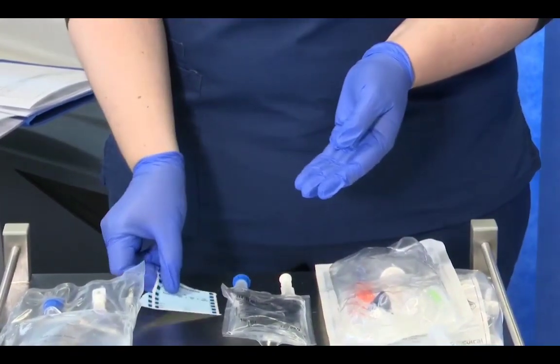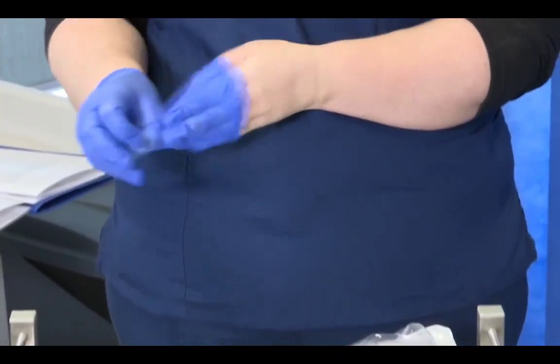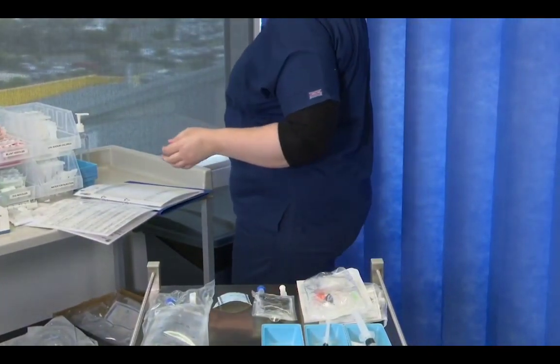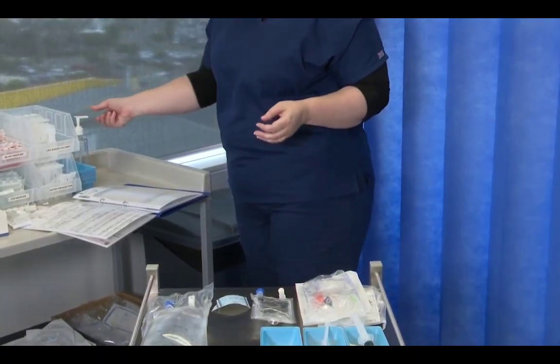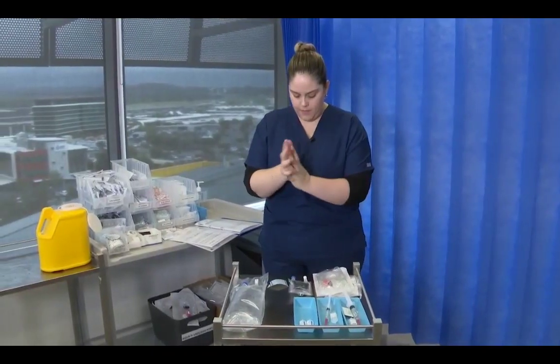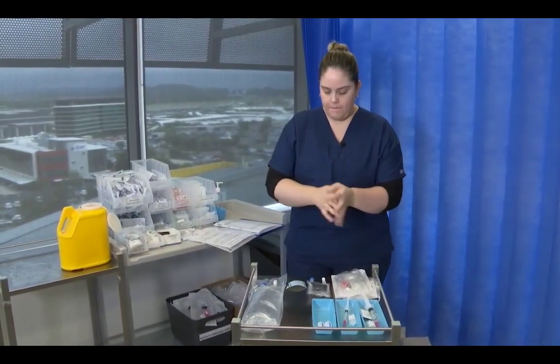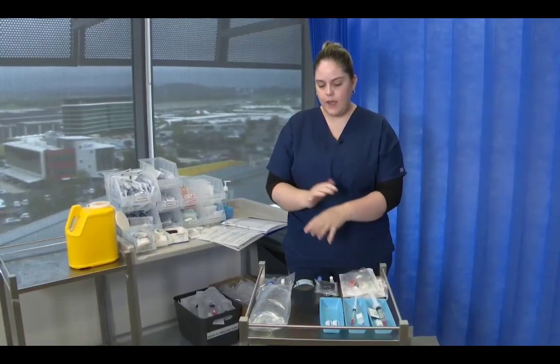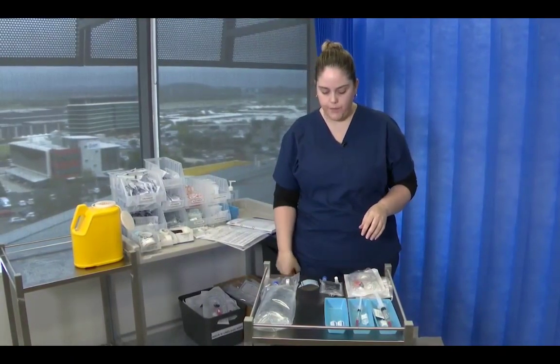So at this point you can remove your gloves. I will choose to. Perform hand hygiene. Okay, and then you and your second RN are going to complete this label.